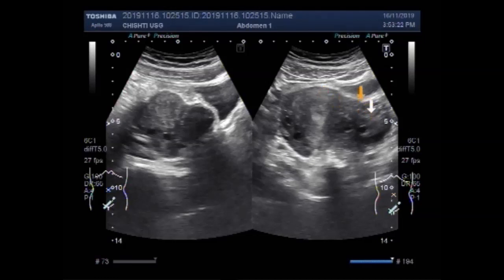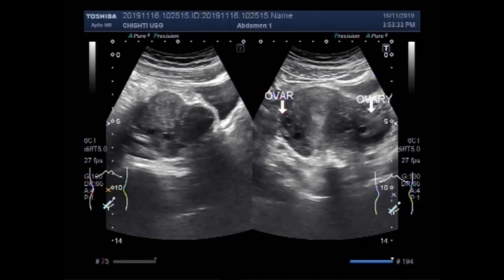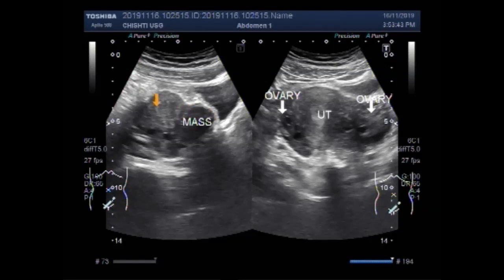This is the right ovary, and this is the other ovary. This is the mass — the fibroid — and this is the uterus.